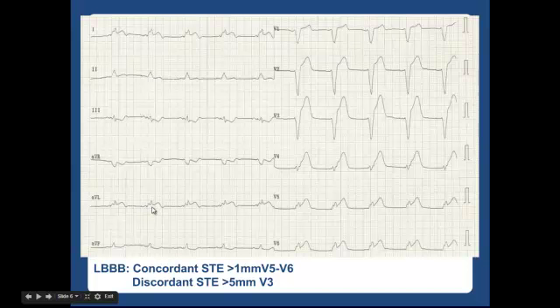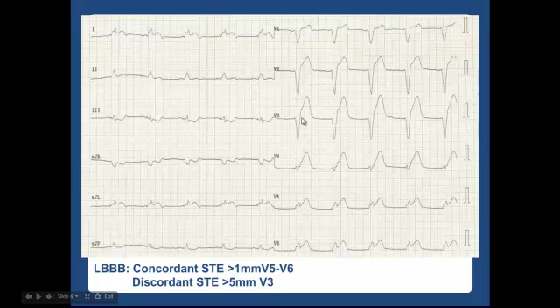In this same EKG you also have discordant ST elevation greater than five millimeters in V3. Looking at leads one, two, and three, we have appropriately discordant waves. However, in V3 the J point is about five millimeters higher, so you have greater than five millimeter ST elevation in the setting of discordant waves.